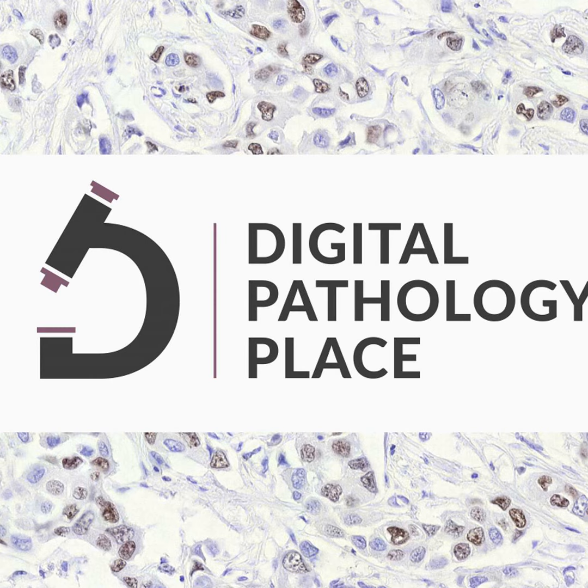How do you know that you can reduce it by 43%? So what they did, they ran this algorithm on those images, and there's a score, right? A score, what's the probability of the EGFR mutation. And they set the score. When the score was very high, the likelihood of EGFR mutation being there was very high.